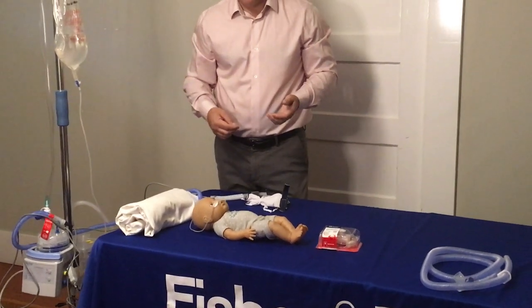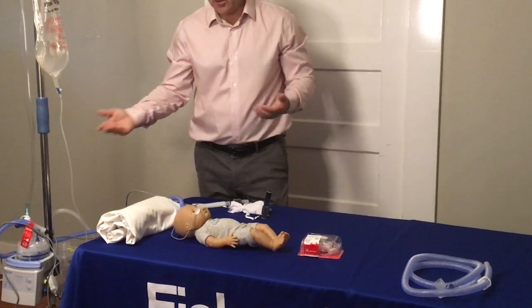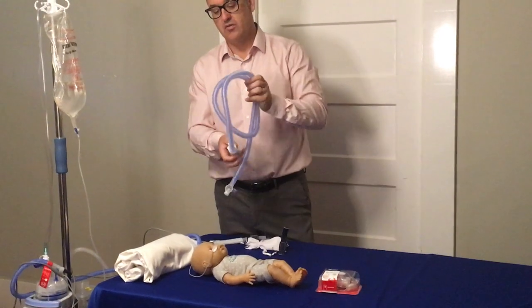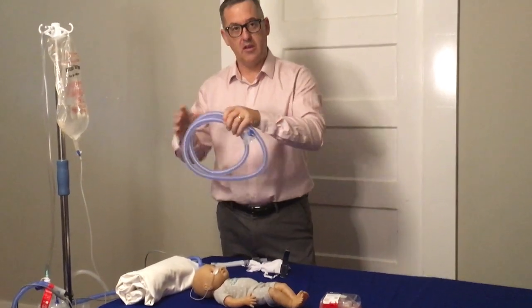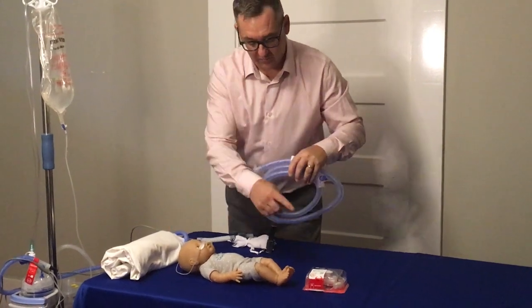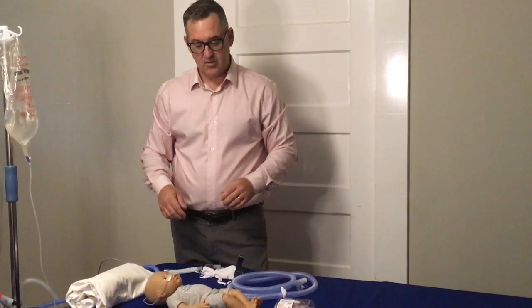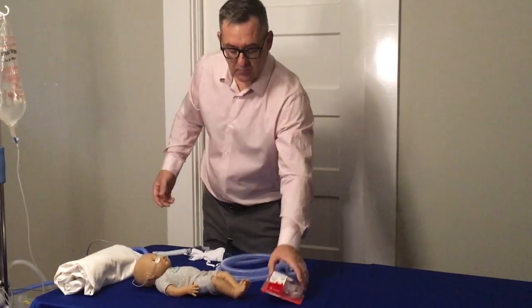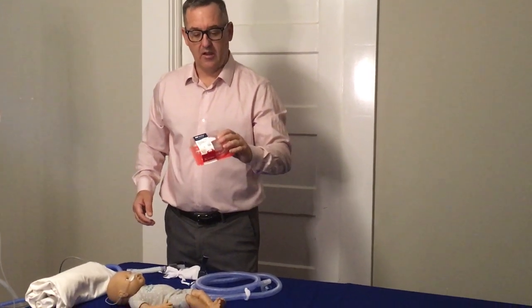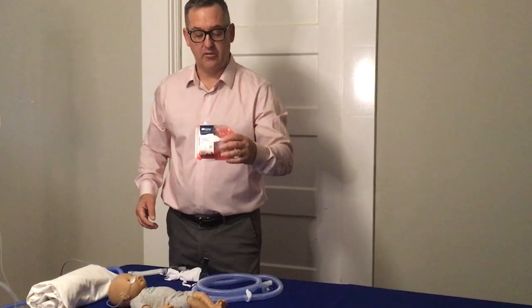Once the baby has been on the system and is doing well on high flow and it's time to change circuits — circuits are changed every seven days — you can move to the RT330 high flow circuit that is designed for this particular cannula. All you'd have to do is take the adapter off and connect it to that. So that is the new transition kit. It does come in all five OJ2 sizes that are available to you. Thank you.